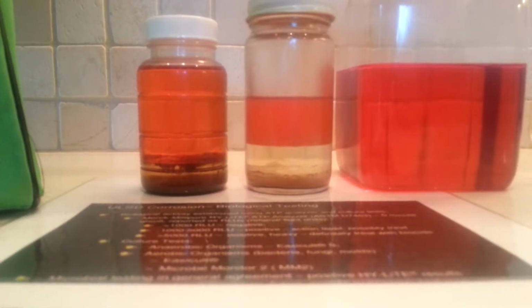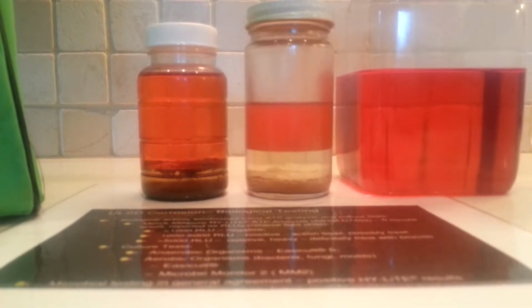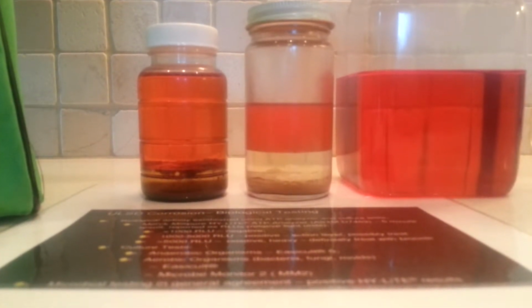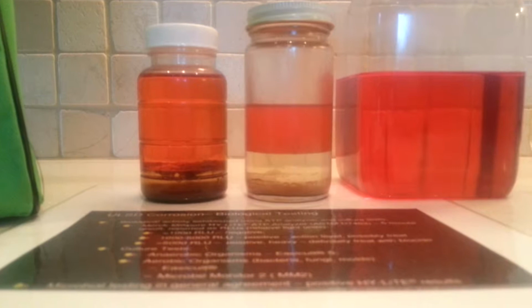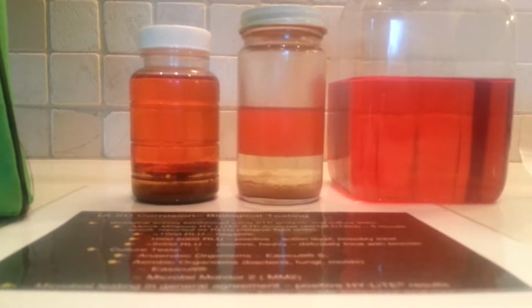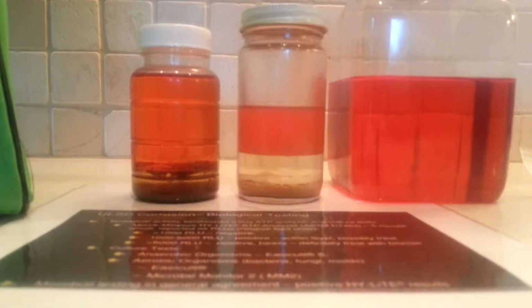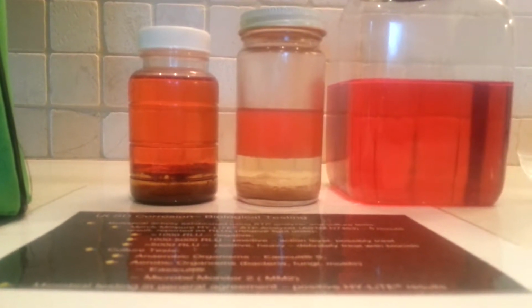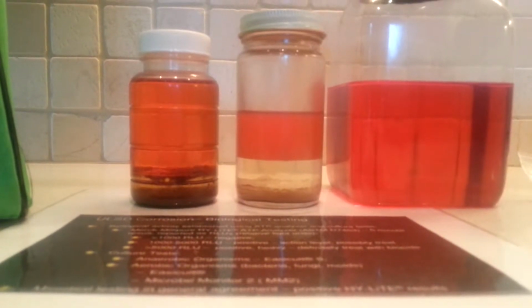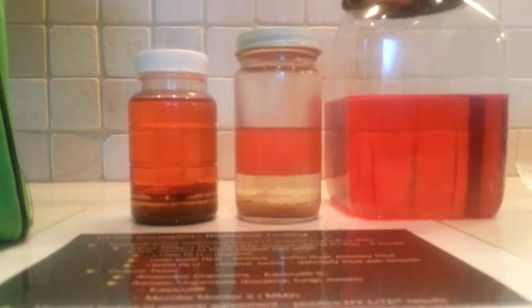In this short video, I'd just like to talk a little about ATP testing, which is adenosine triphosphate testing. ATP, which is basically looking for microbiological growth, is a molecule found only in and around living cells, and as such it gives a direct measurement of biological concentration and health.